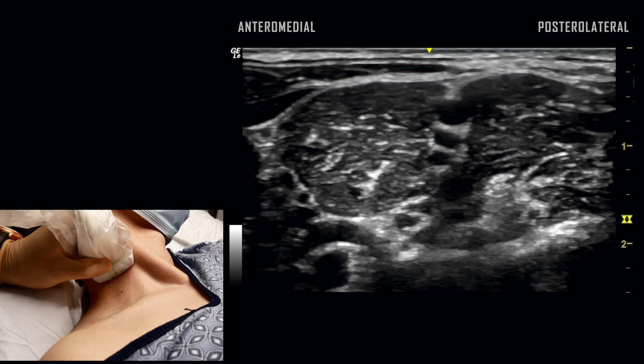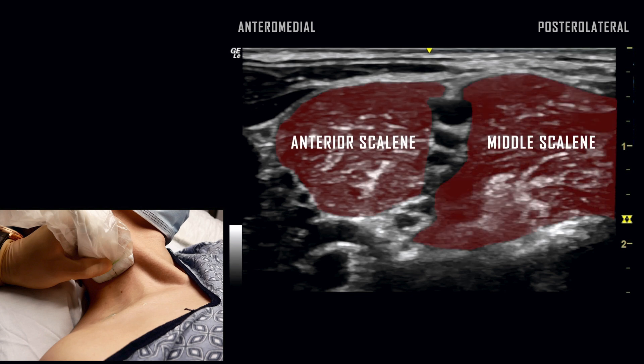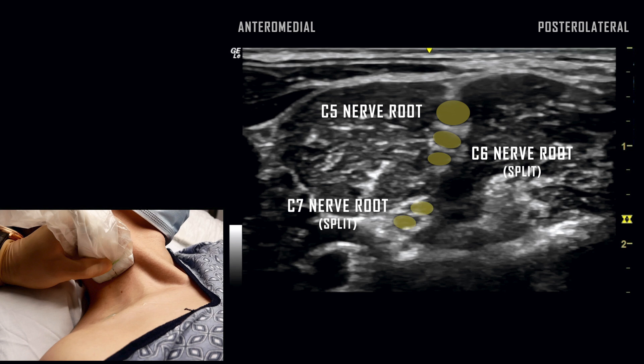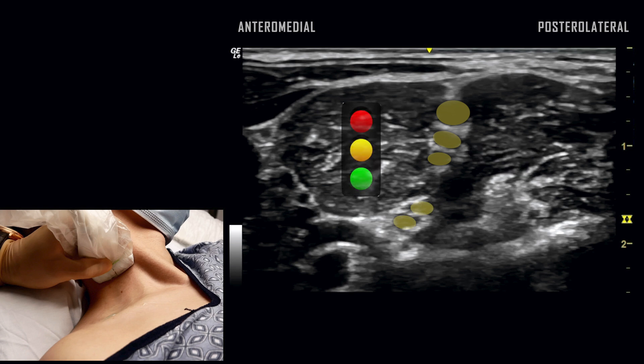The nerve roots of the brachial plexus are visualized between the anterior and middle scalene muscles. Here we see the C5 nerve root, a split C6 nerve root, and a split C7 nerve root. The structures are commonly described as a traffic light sign within the interscalene groove.